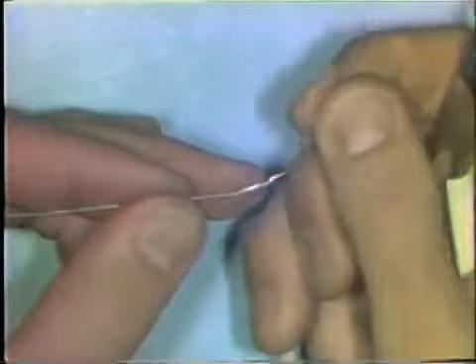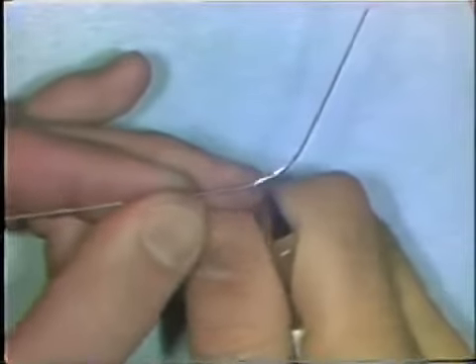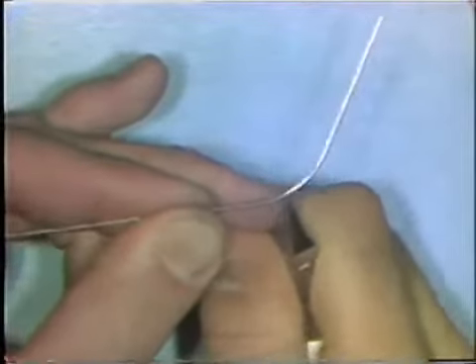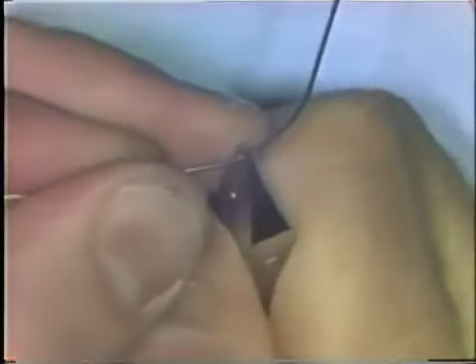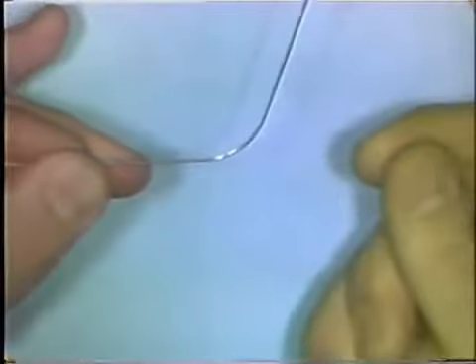To increase the curvature in an area that's been flattened too much, right along here, there's curvature here and curvature here, but a little flat section right through there. You place the wire back in the beaks of the plier and make 2 or 3 small bends very close together, and this will take care of those overly flat areas.